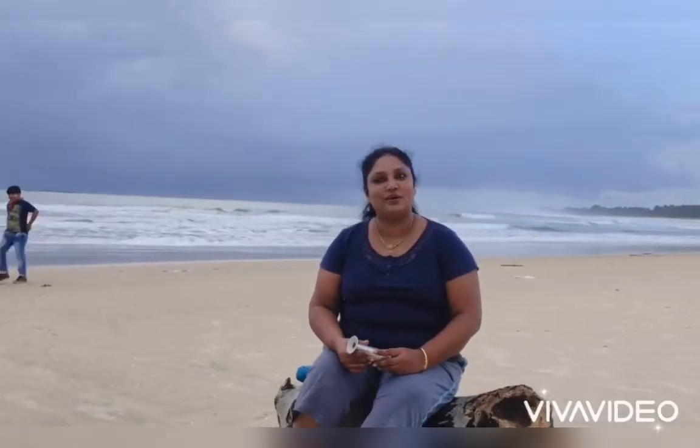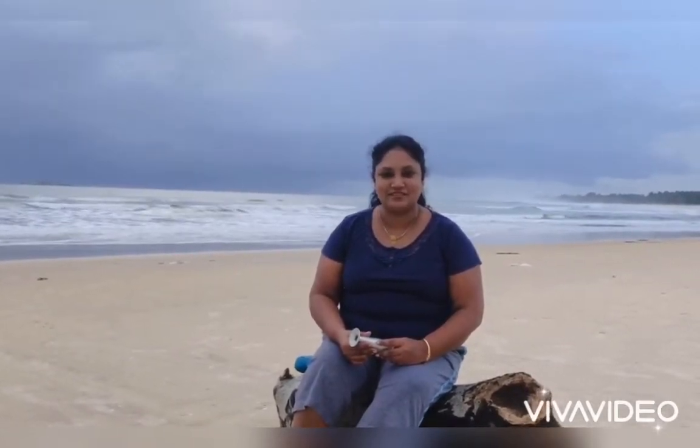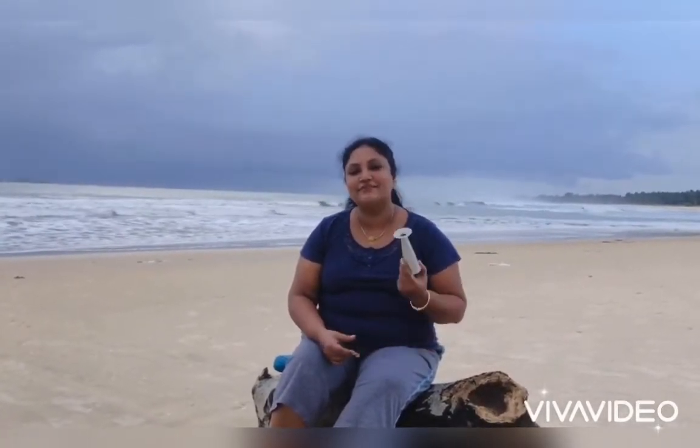Hello students! Today we will be going on to one more instrument. This instrument is also used in obstetrics and gynecology examination. I am sure that all of you have seen this instrument. So today we will be looking at an instrument that is a fetoscope. I hope all of you have seen this instrument.